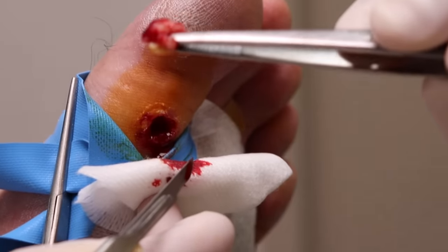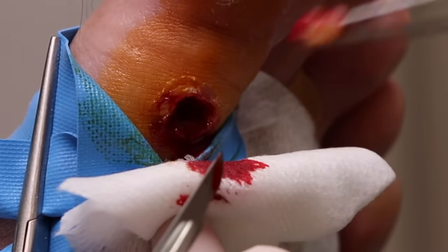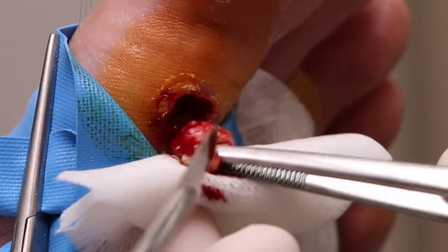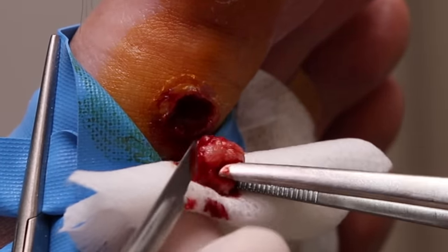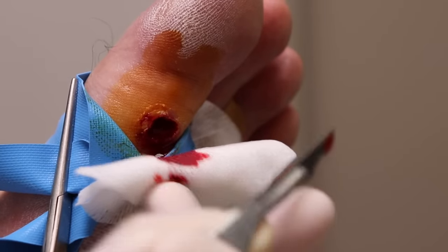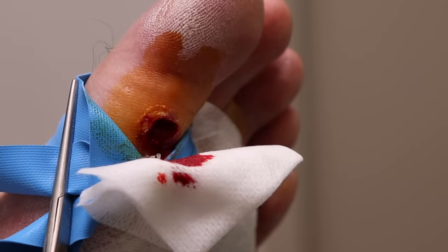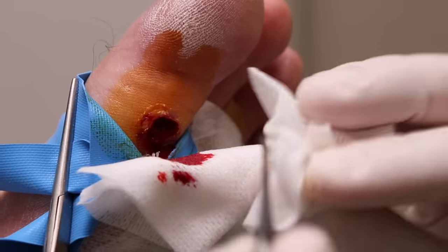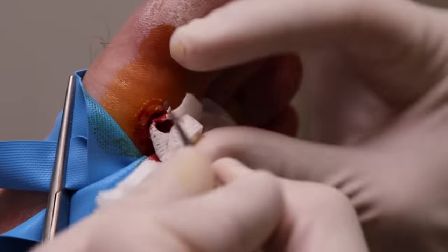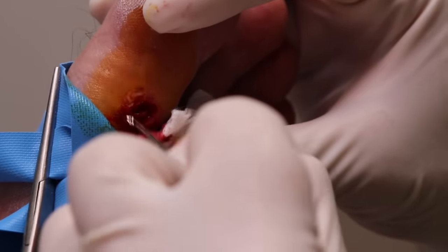Do you see that? It's like a little pellet — that's what it feels like. Like a corn or something, unbelievably thick. That's the bulk of it out. Now it's a matter of just clearing out the area around it, making sure there's nothing left behind.